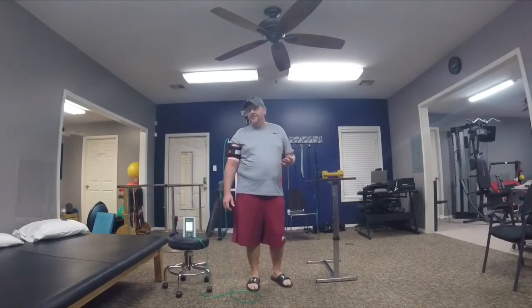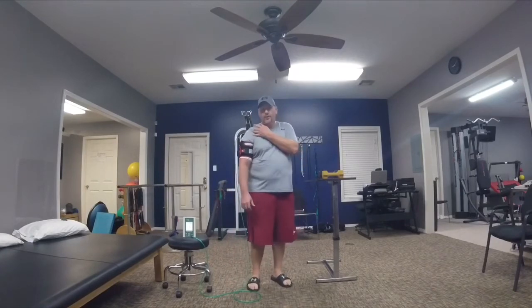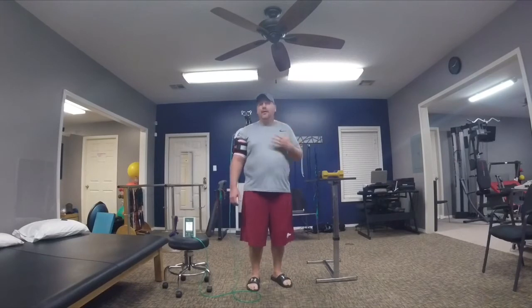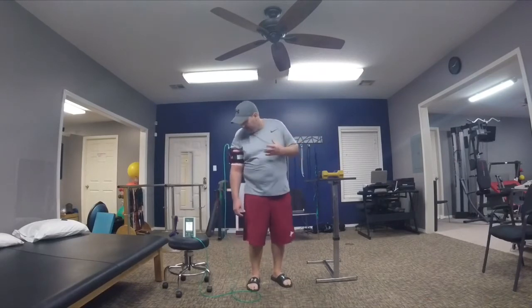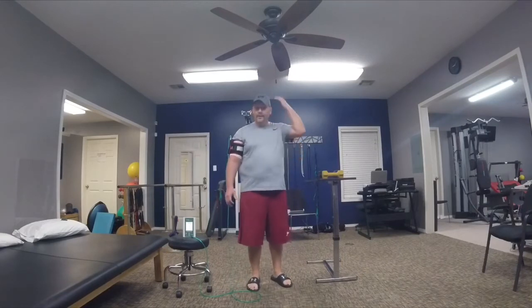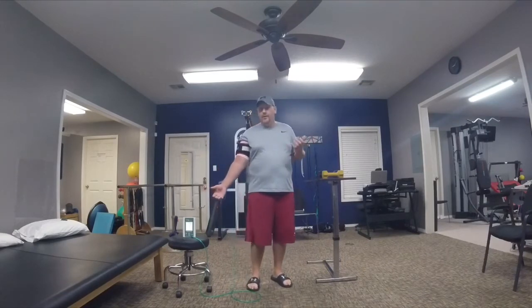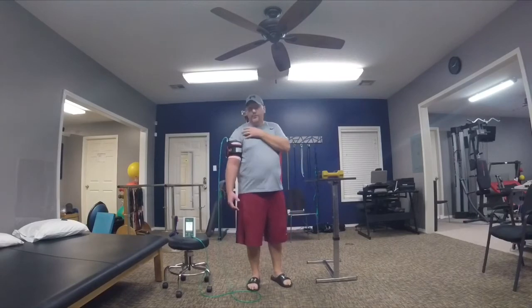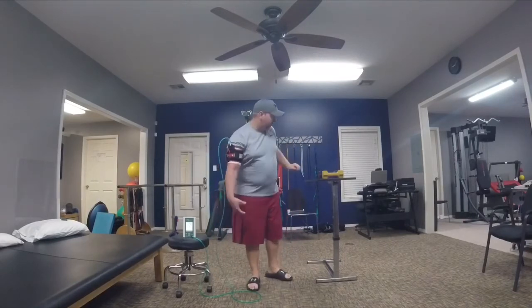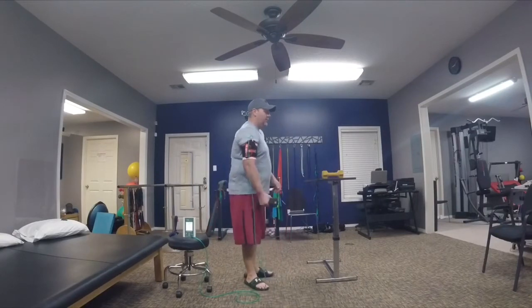You get a lot of benefits from this, even proximal to the cuff. I feel like right now I've been running a little bit, kind of getting a little bit short-winded. This growth hormone release goes all over my body, so if I've got a rotator cuff repair or something more proximal, then this should also benefit that as well. Let's see if I get 15 more.